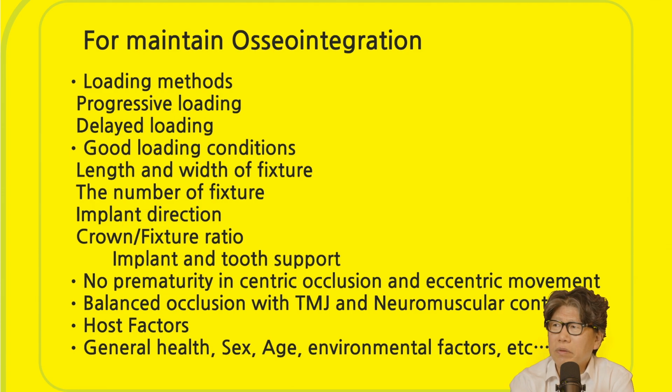I don't really know, but even in elderly patients, I don't think I've seen too many cases of osseointegration failing because of bad bone. Actually, downstairs in my hospital, I'm on the 4th floor, and on the 2nd floor we have an internal medicine department that specializes in kidney dialysis, hemodialysis. So now they send a lot of extremely debilitated patients to us. But I haven't seen a case where the implant won't go in because the bone is bad.